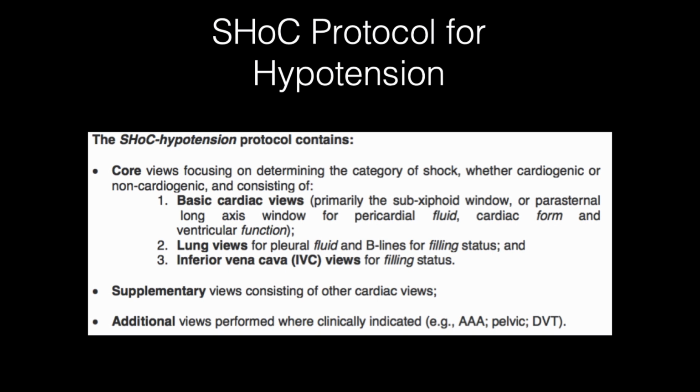The inferior vena cava will be grossly assessed and will allow us to evaluate for plethoric IVCs, which may indicate volume overload or obstructive shock, and very collapsible or small IVCs that may indicate hypovolemia or hemorrhagic shock, and allow us to make some judgments on resuscitation efforts.